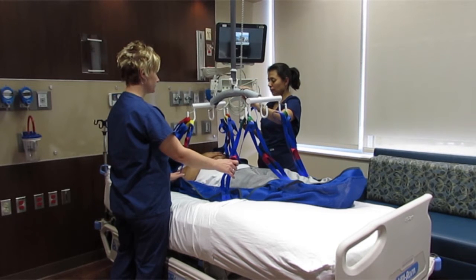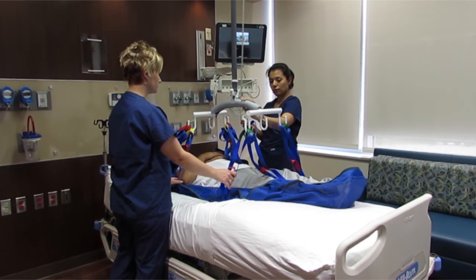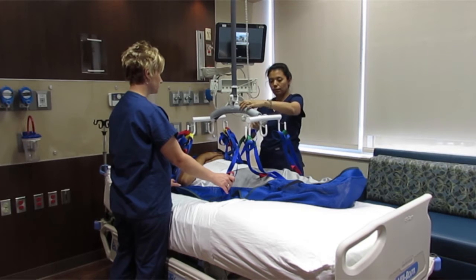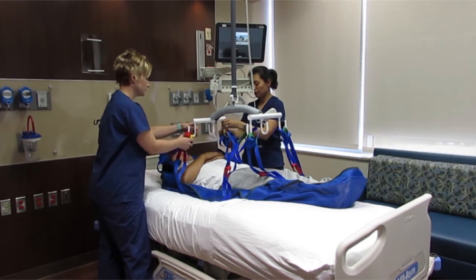Lower the patient down on the bed and disconnect all the straps from the spreader bar hooks, starting at the head and working down towards the feet.